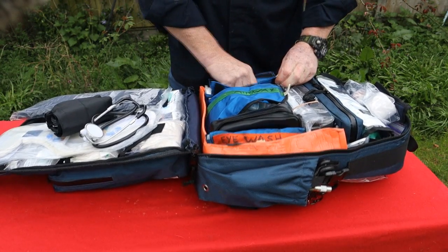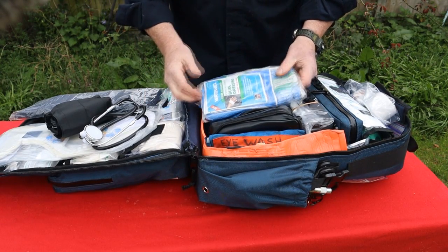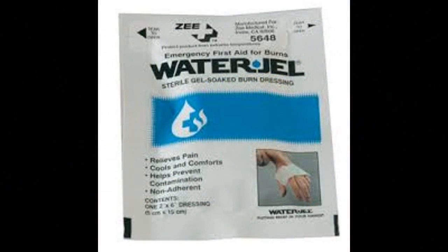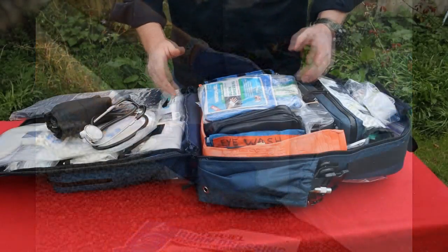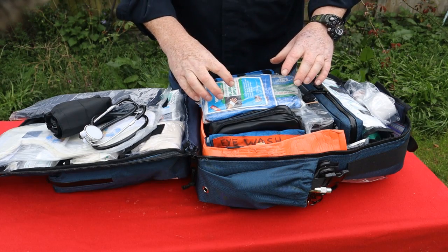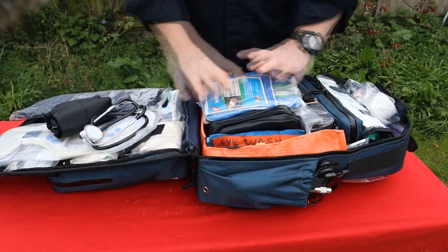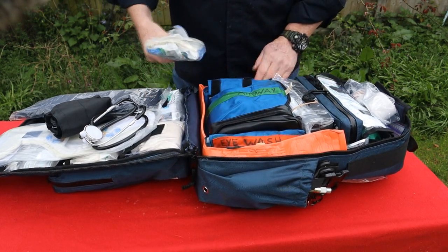Up here I've just got burns gel dressings. So these are all water gel burns gel dressings. What I've got in here is a big face mask. Well, I wouldn't necessarily just use it for a face, that is a big dressing. If I've got a big burnt area, I'd gladly use that dressing on it. They come with a sort of jelly, sort of yogurt-y type effect. Their function really is to draw heat out of the wound, but with burns, really simple: cool and cover. I think that's probably all we're going to be able to do with burns.